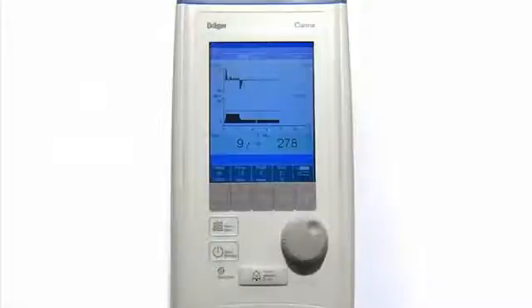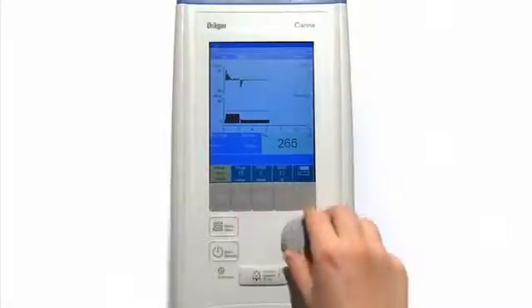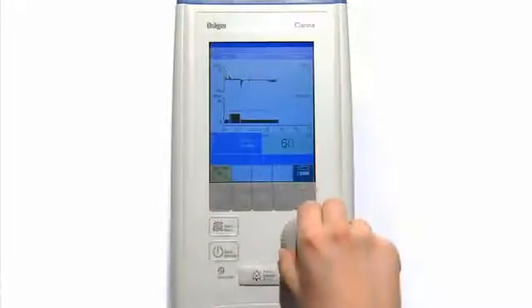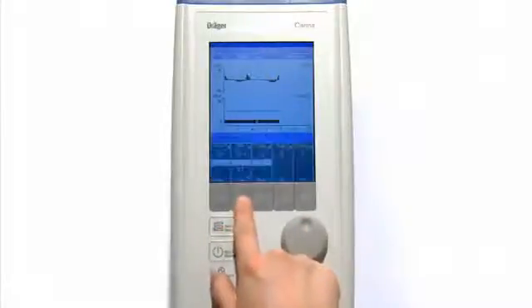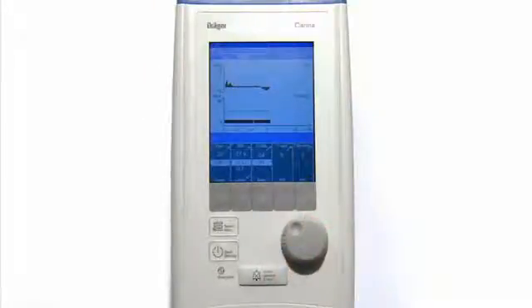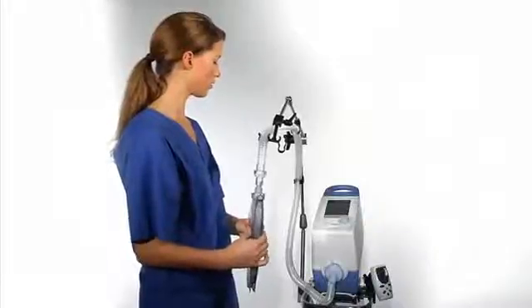Please change ventilation settings to SPON CPAP. Settings: apnea ventilation on. Alarm: T apnea, 5 seconds. The alarm T apnea allows the user to determine the apnea alarm time and the apnea ventilation start time.